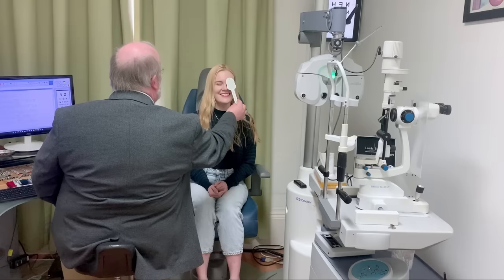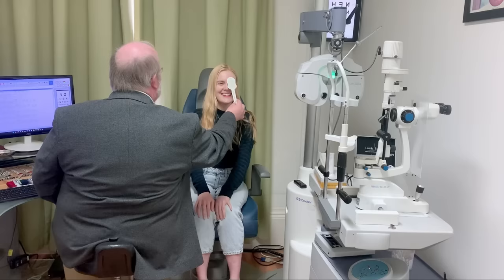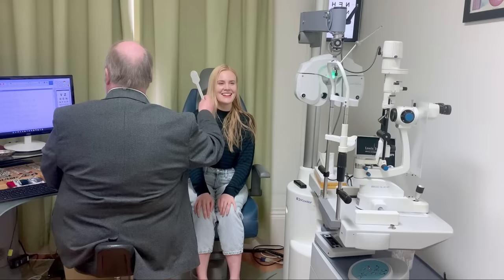Any of the next one at all? I think some of them I can. I can get the N. But I don't know if that's an F or an R. Oh, right. And then it's an R. Oh, yeah. No, the second one is an F, if that's enough. Okay. Am I overthinking it? No, a good guess is fine. Z and H. Yeah, I could read that one. It's just a bit blurry. And is the next one down? No. We pushed, didn't we? It was a P.